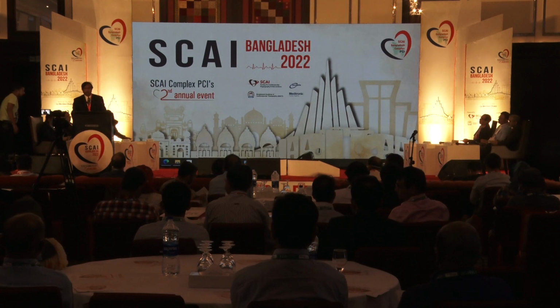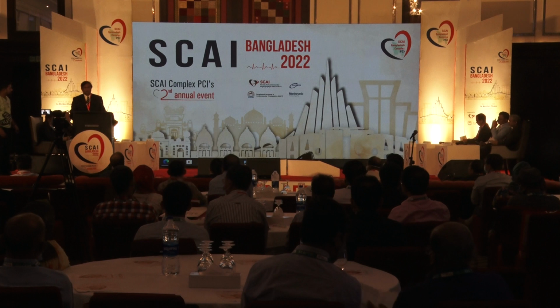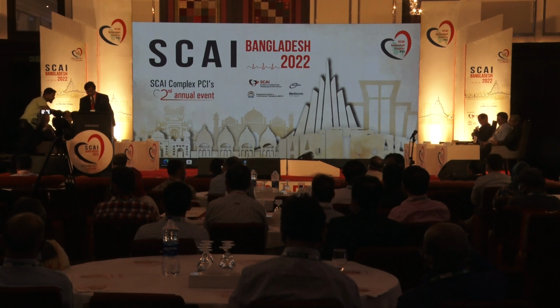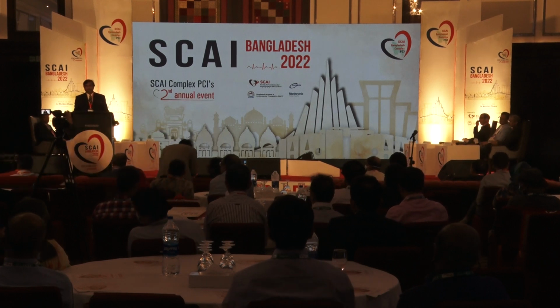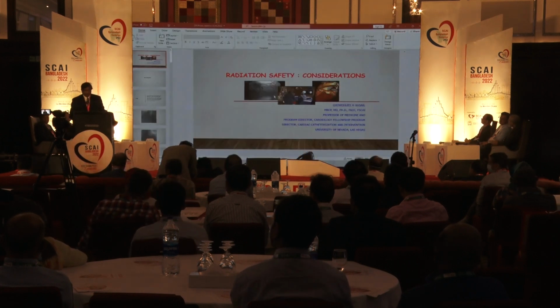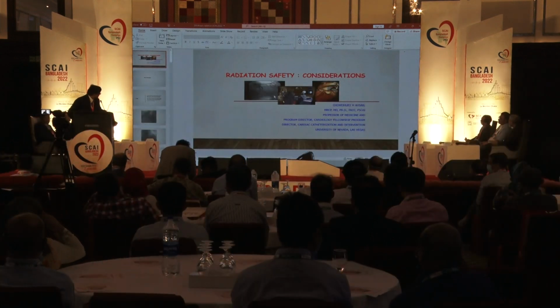So one of the most boring topics in any interventional conference is radiation. So let me show you a case. Maybe that will interest you, to pay attention to the radiation dose and what we need to do for radiation safety in the cath lab.